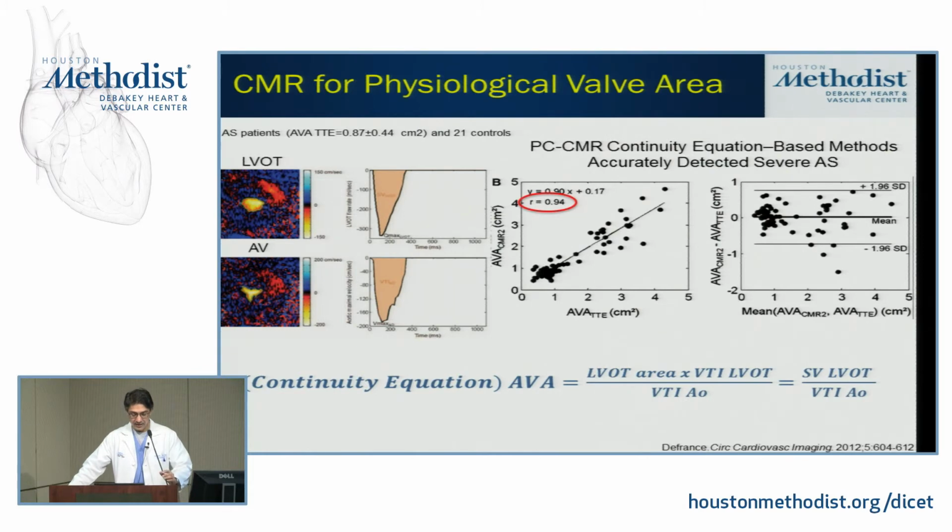Now, one of the things that's always come up is, can you actually calculate a physiological valve area? And we had Dimitri, who also worked on this extensively, and next year I'll have his slides also as part of the presentation. But yes, it is possible for us to calculate a physiological valve area along with our anatomical valve area.